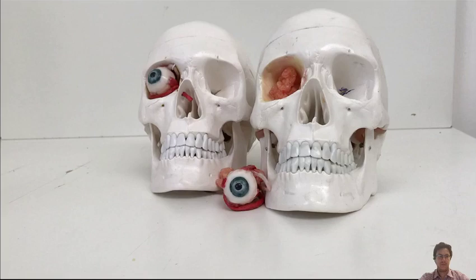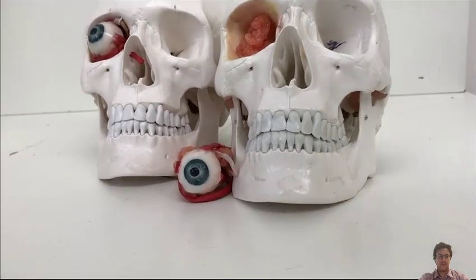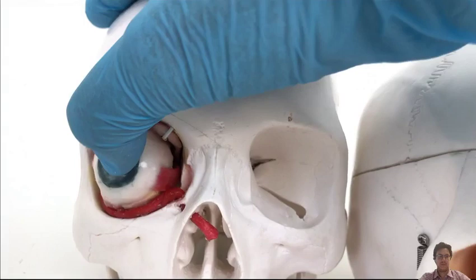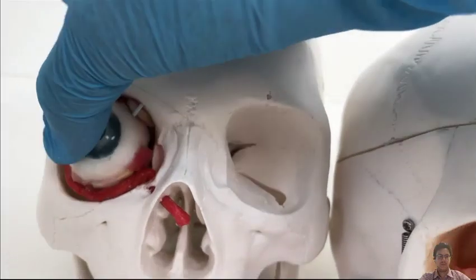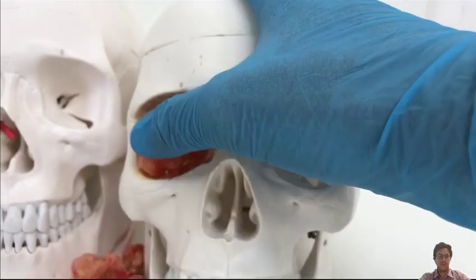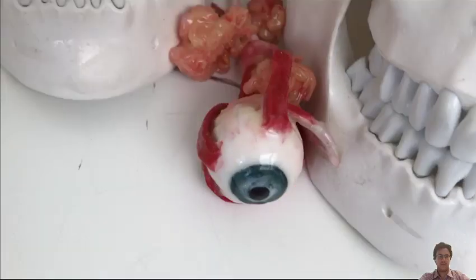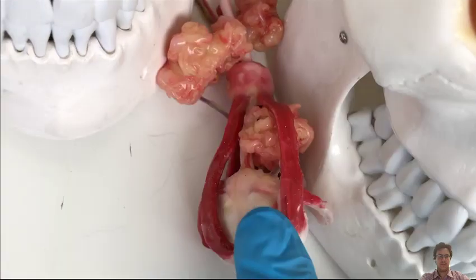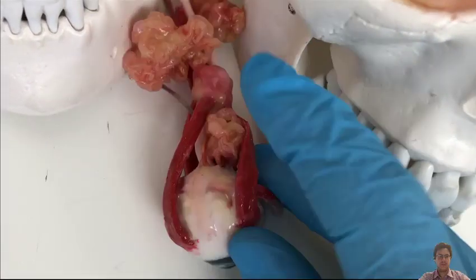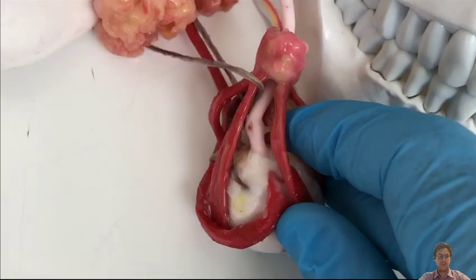The next task was to identify what platform we could evaluate the robot on, since no phantoms exist for this procedure. From MRI scans of patients, we segmented all anatomical landmarks and collaborated with the Royal College of Art to create a very realistic eye phantom and phantom of the orbit. We created the muscles with different types of silicone, then painted everything, adding vessels, the optic nerve, and suturing approaches, resulting in a very realistic phantom on which we could evaluate our robot.